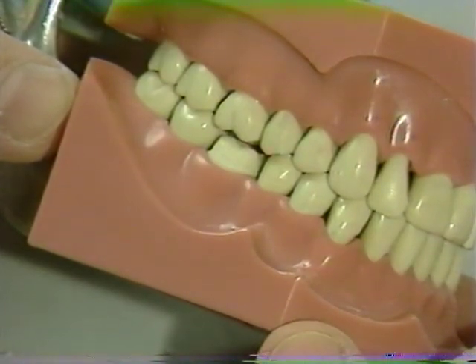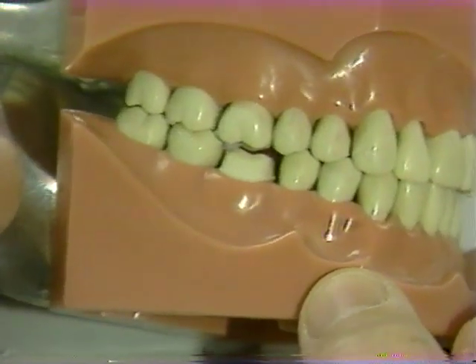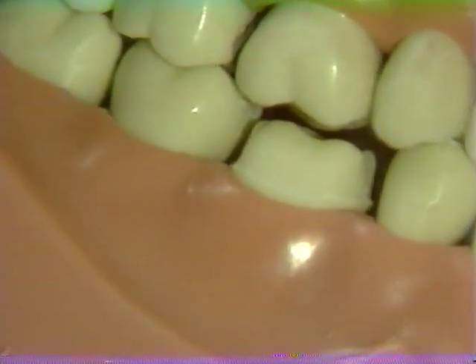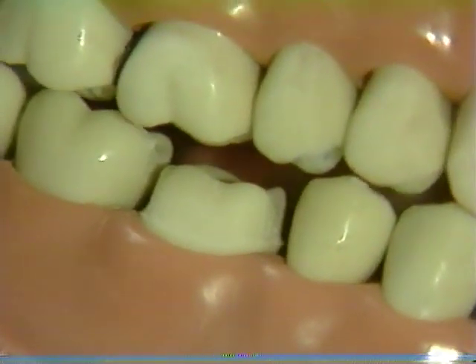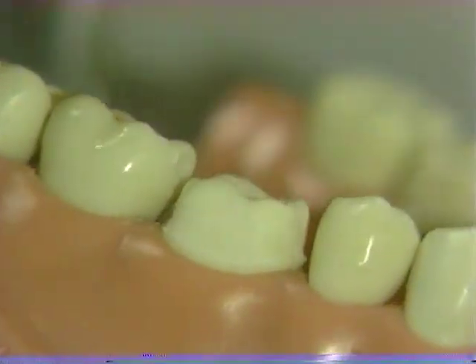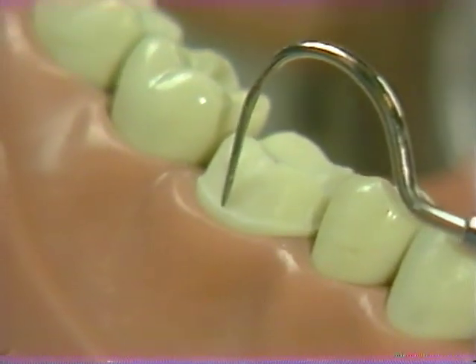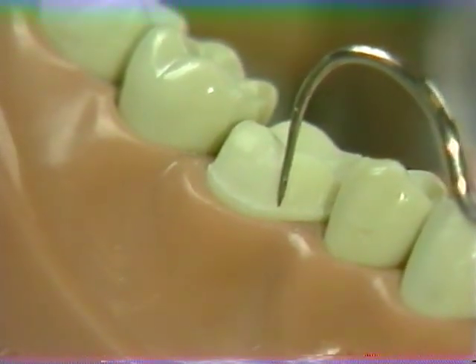The completed preparation is evaluated at this stage. Note that adequate occlusal clearance is present not only in the occluded position but also in the excursive movements. Do not forget to check the protrusive movement at this stage. The chamfer is then evaluated — a proper chamfer will offer resistance against vertical displacement of the sharp explorer.